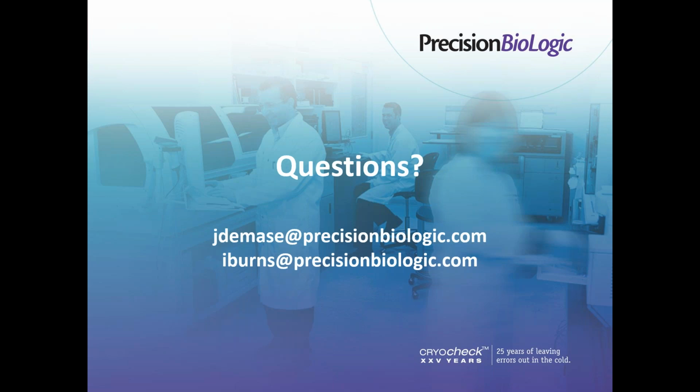Ian, I've got one just come in here. Can you refreeze HexLA after thawing? So no, you can't refreeze the reagents. It does have an 8-hour onboard stability, which is similar to StaClot LA. Both reagents have an 8-hour stability claim.